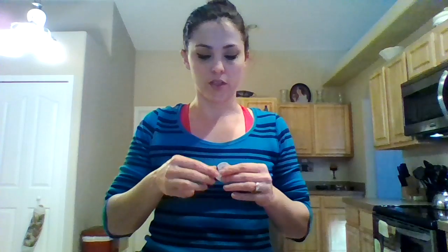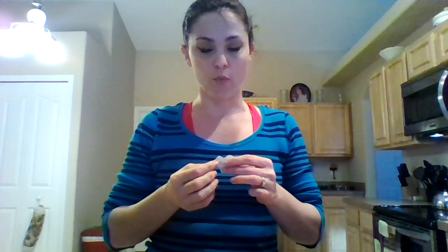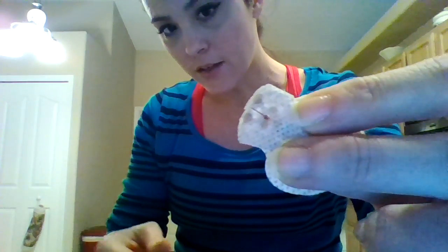I did just want to show you though that I already took out, sorry, the camera's a little odd because I wanted you to see where I was putting it in at. So probably in and out of the camera a lot. But I wanted you to see what the sensor looks like once I take it out so you can see what's actually in your body. So I'm going to see if I can get that.